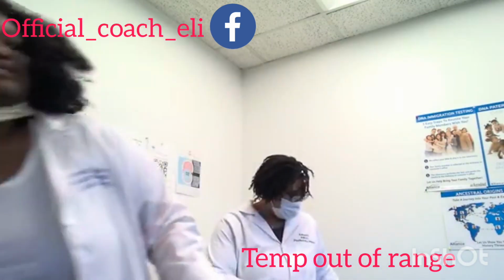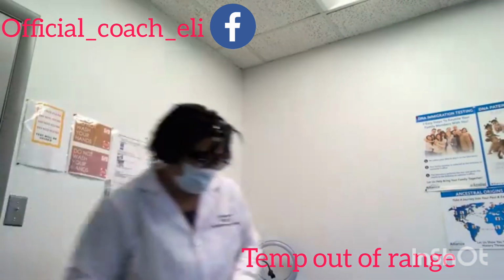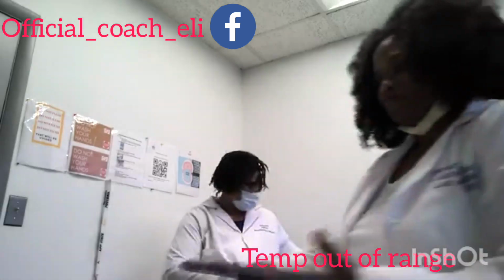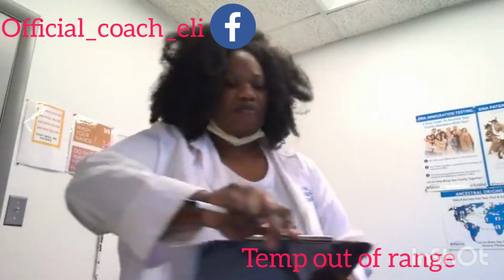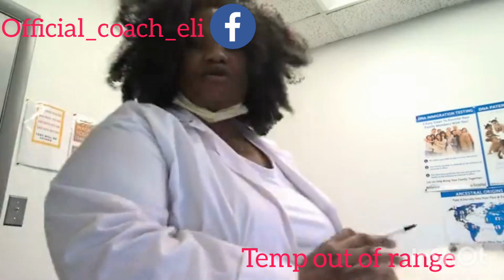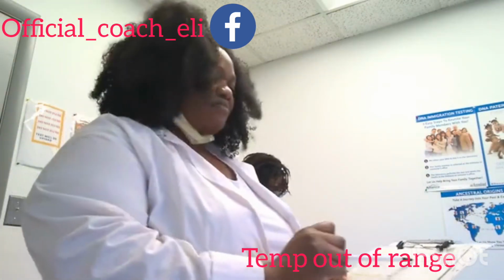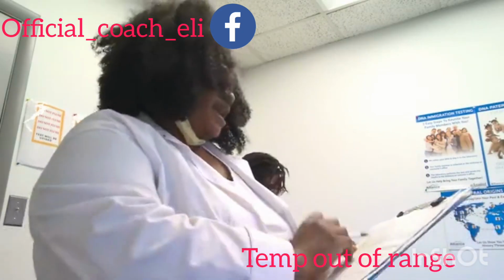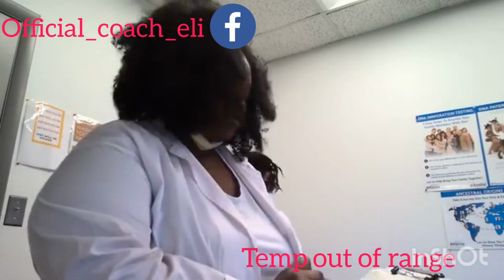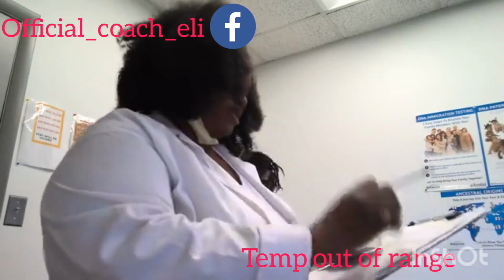Remember, guys, on my federal step 1 form, sections A and B are automatically pre-filled. A is asking for the employer name, B is the MRO, and C is asking for the donor's social security number or ID. I have an ID number here, so I'm going to put it down.